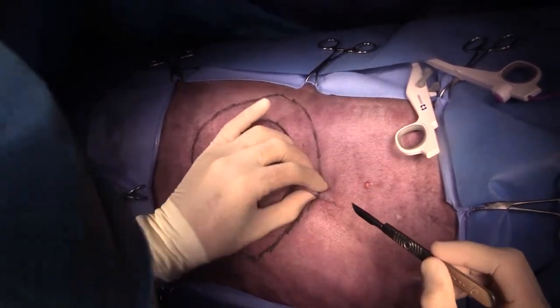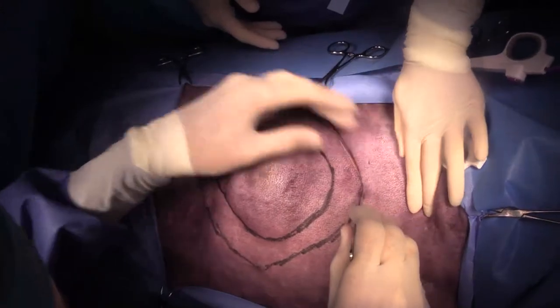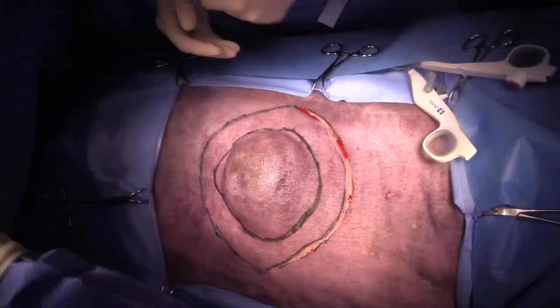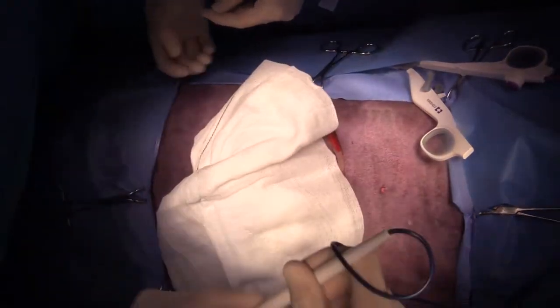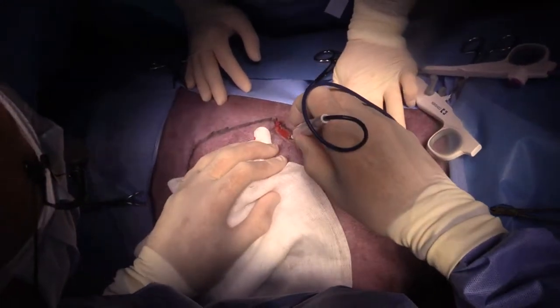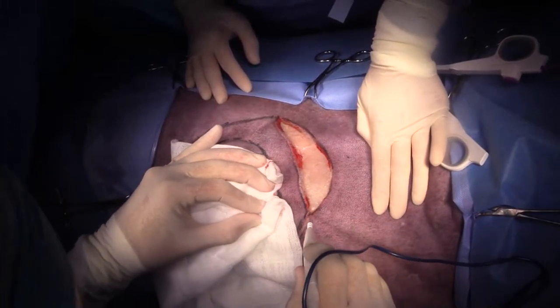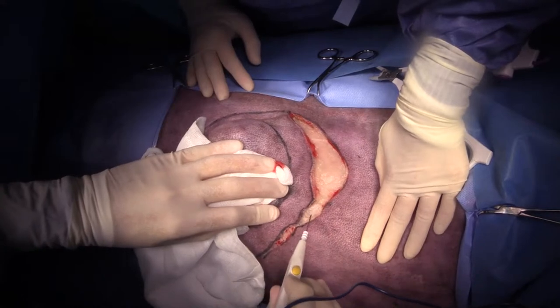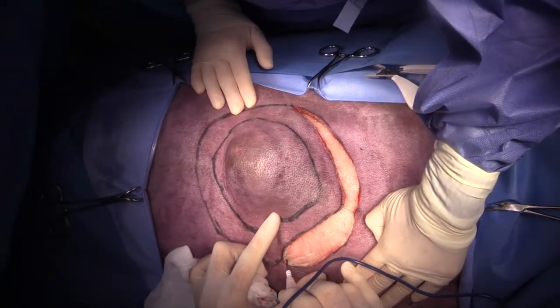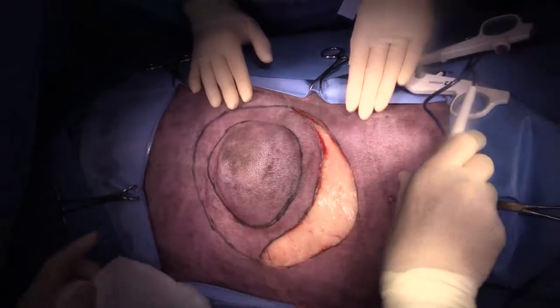I think that's just fat right there. And so you can see how Sarah's providing counter tension on the skin. It really, really helps divide the tissue planes. Come around the other side now.